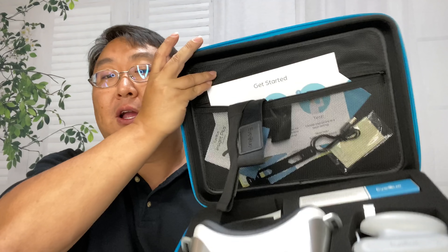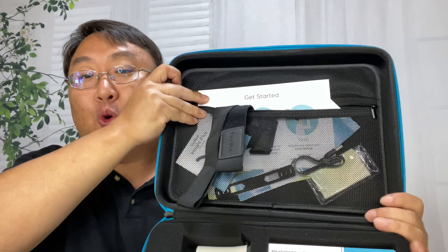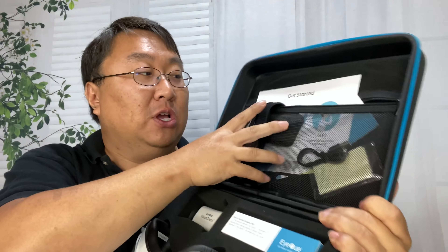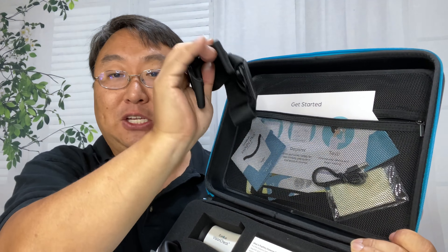First of all, let's take a look at what you get. You get this hard case and it comes with a bunch of stuff. You can order these components separately, but if you order this complete case it comes with just about everything you need and then more.